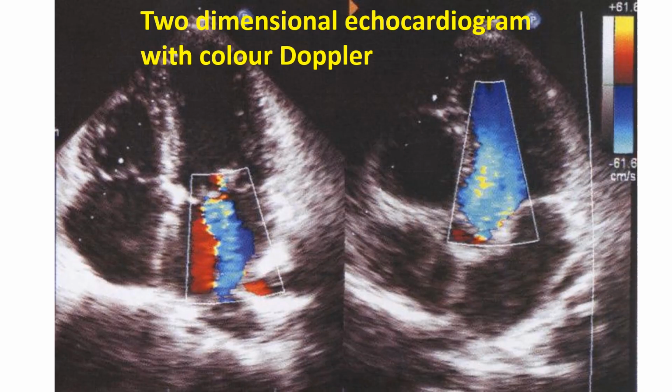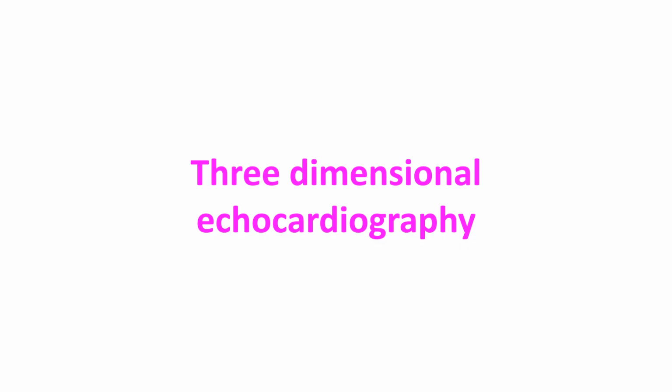Two-dimensional real-time imaging gives the live images of the cardiac chambers and valves. This gives excellent anatomic information of the cardiac structures. Opening and closing of valves can be visualized well. Structural abnormalities and abnormalities in the motion of the ventricles and valves of the lower chambers of the heart are well studied by two-dimensional echocardiography. Three-dimensional echocardiography gives good spatial orientation of the cardiac chambers.